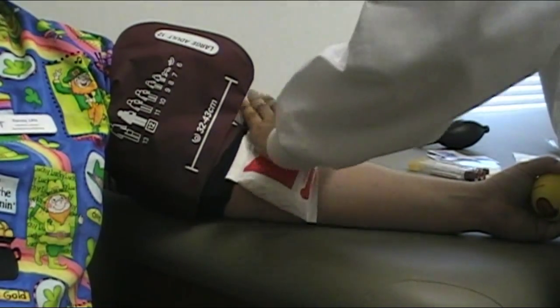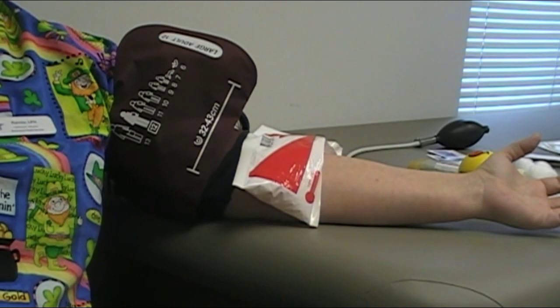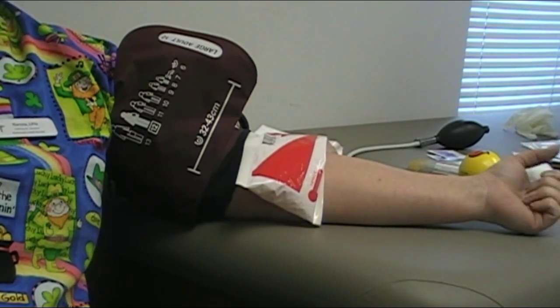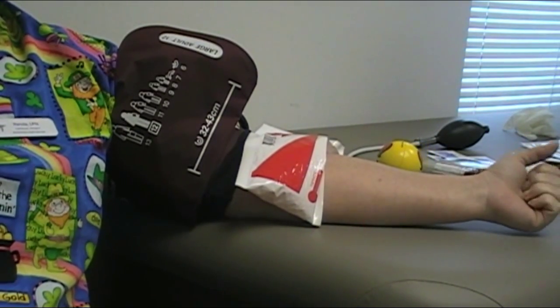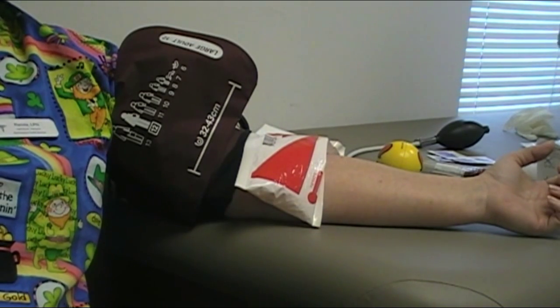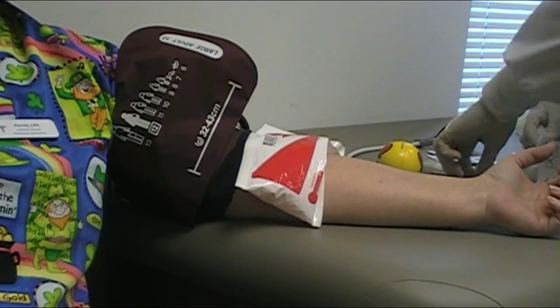Okay, hot pack for a few more minutes. Take the ball out of her hand; let her open and close her hand with it. The big difference between a blood pressure cuff and a regular Penrose drain-type tourniquet is that it exerts a lot more pressure on a larger area. So you want to make sure your tourniquet time is shorter than it normally would be with a regular blood draw. If you take the pressure off for a while once you've found it, it will let some oxygenated blood flow into that limb and we'll get good lab results without stressing out the patient too much.